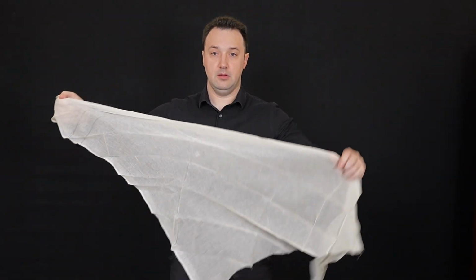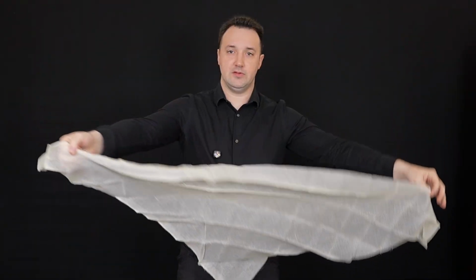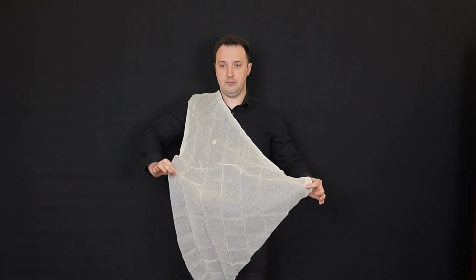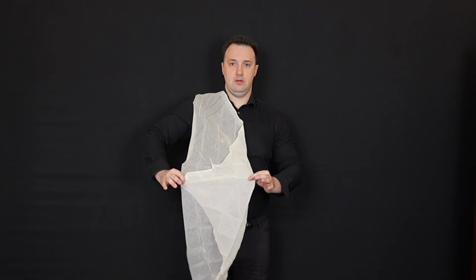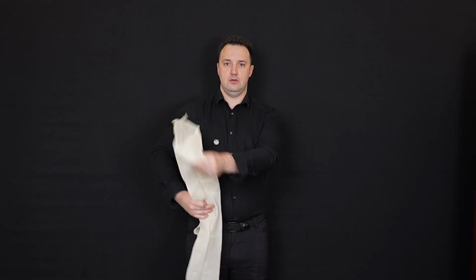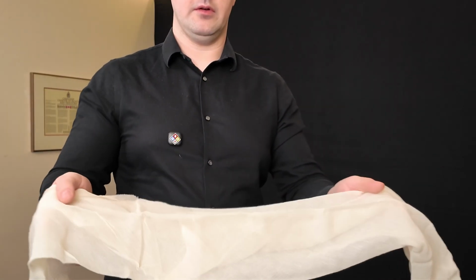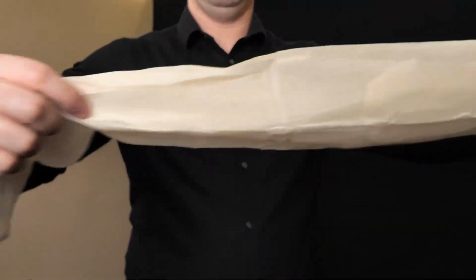Let's just grab that. Like so, and then I'm going to do it 90 degrees from this on me, and then what you're going to do is fold from the point to the base. And then do it again, same fold one more time in half. And you've got a long, broad strip. And we'll show you here, we've got a long, broad strip end to end.